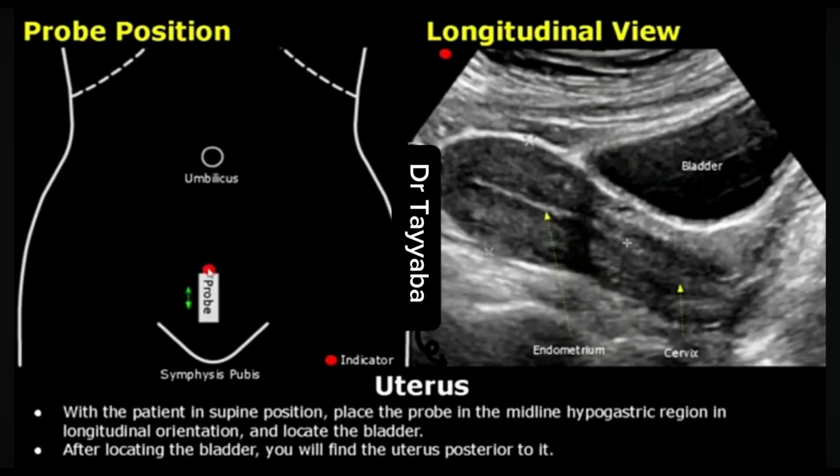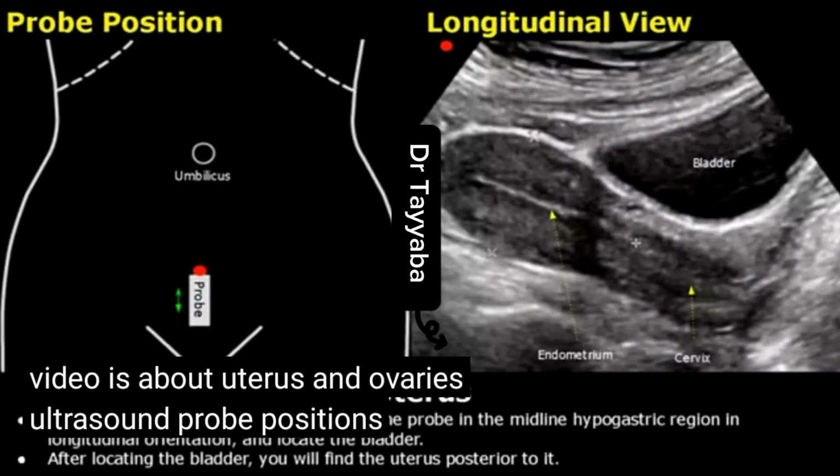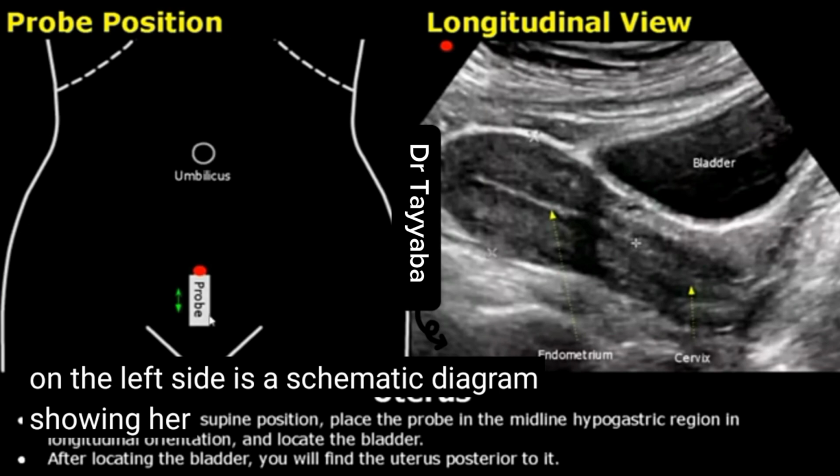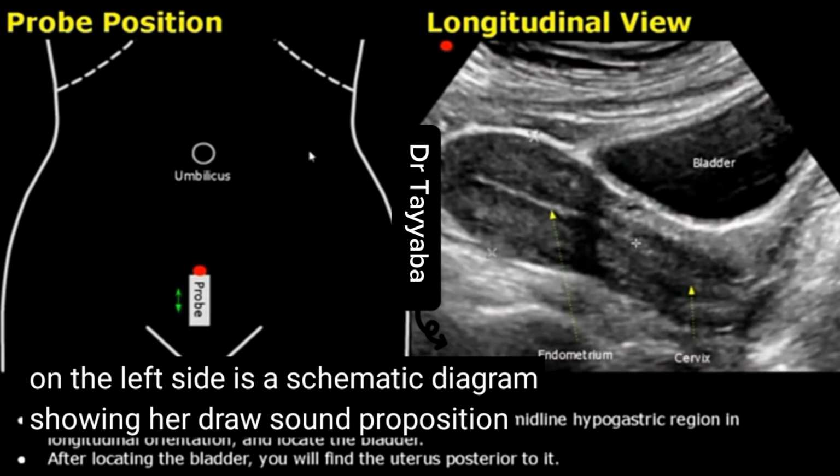Hello everyone, it's Dr. Teba and this video is about uterus and ovaries ultrasound probe positions. On the left side is a schematic diagram showing ultrasound positions.